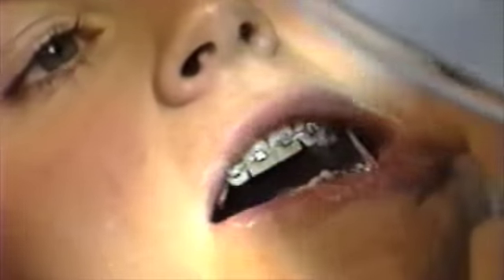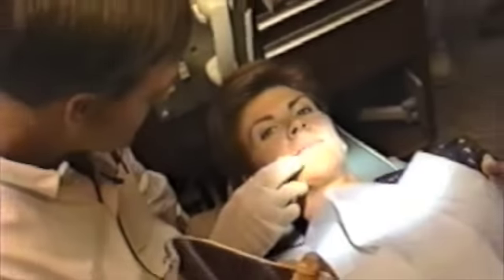This is one disadvantage of using a small bracket — the bracket error incorporated at placement must be corrected with wire bends at finish.